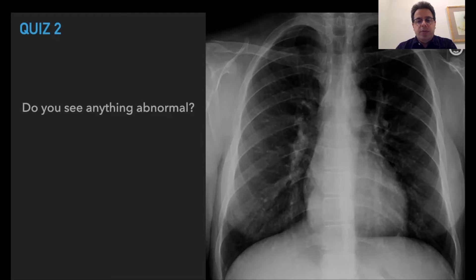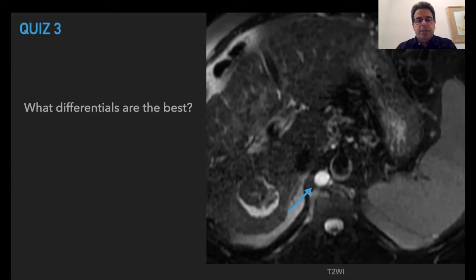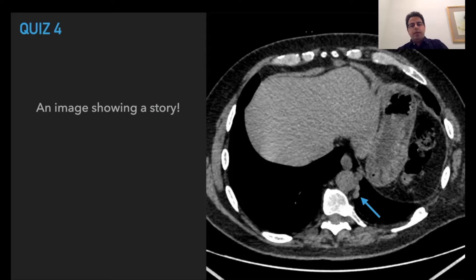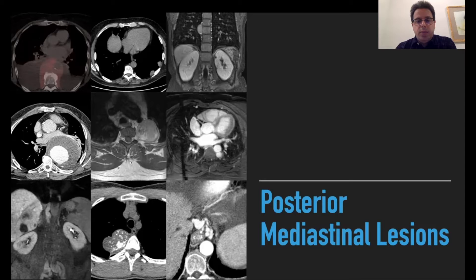Case number two: do you see any abnormality in the mediastinum? Case number three: what is this structure? Case number four: what are the differentials for these small soft tissues adjacent to the aorta? We're going to come back to these cases in the subsequent 10 posterior mediastinum lesions that we're going to review together.